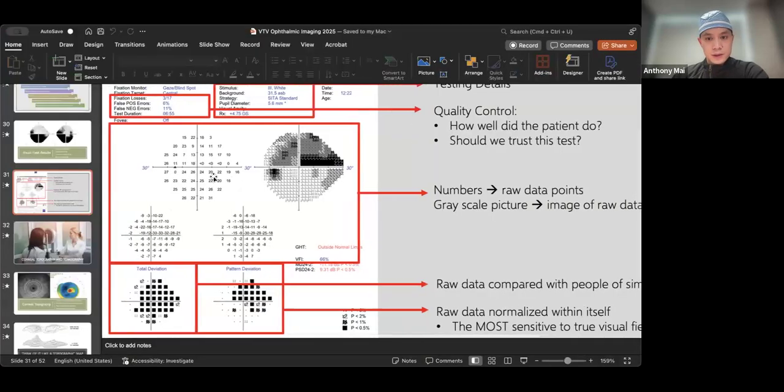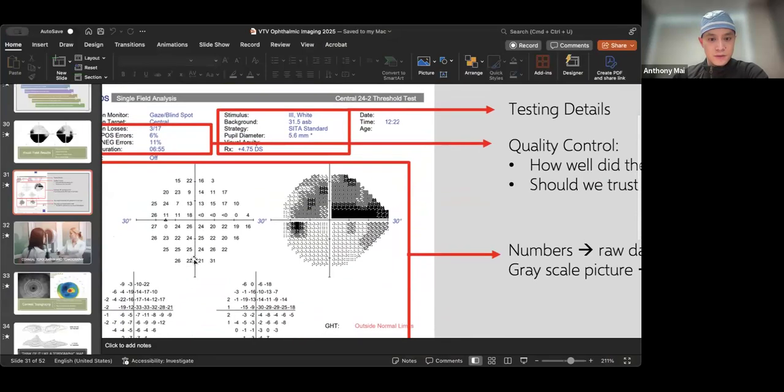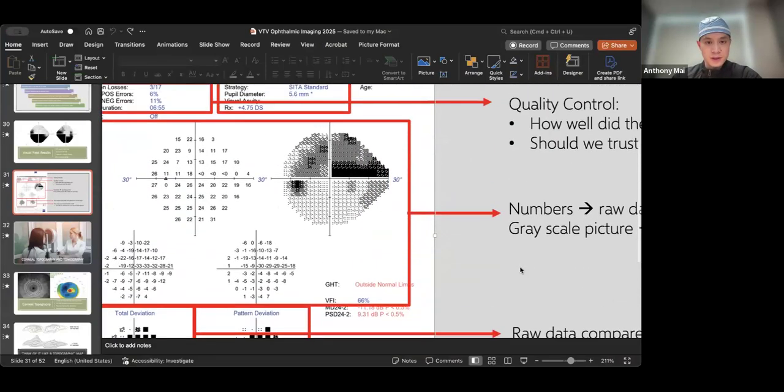I think I might see what they're talking about if I can just share my screen again real quick here. So in the raw data, they might be talking about this area. Those are the raw values here that then point to this. If you can see this area, that's all normal, and that's in the 20s, so mid 20s. As they drop down, 0 right there is when it starts getting black. So you've got about mid 20s going down to some areas that are 7, 13, that correspond to more gray area. So that's probably the raw data they might be referring to.